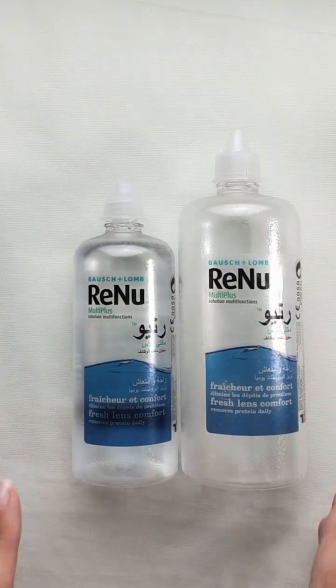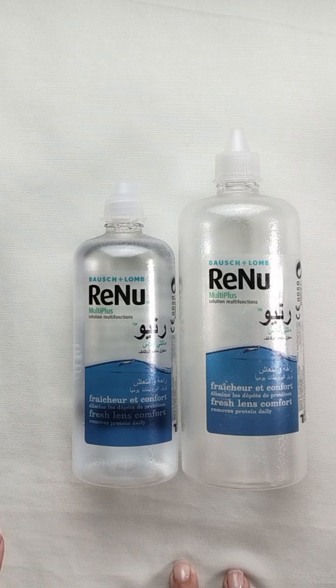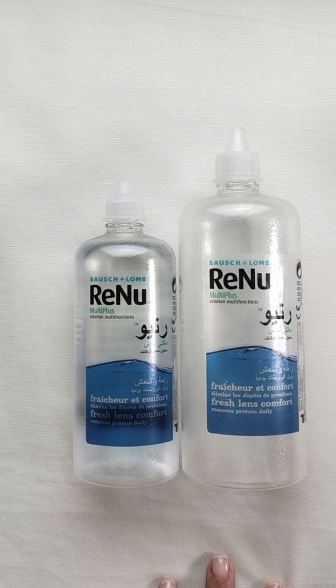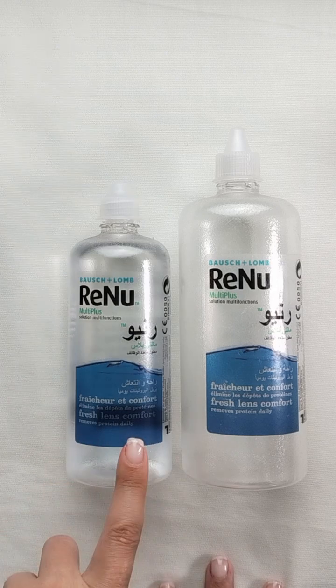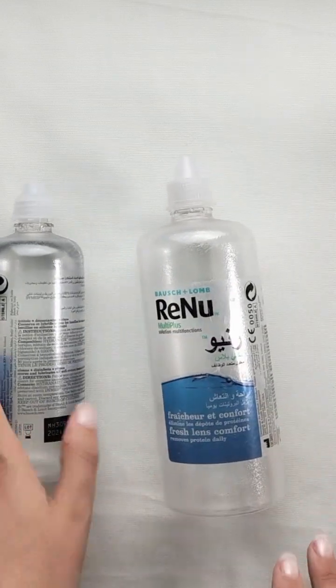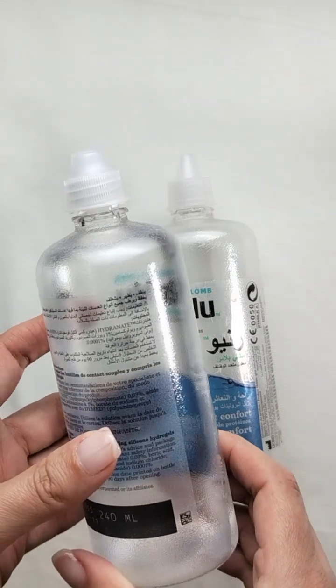I really love it because it makes my contact lenses very clean and very soft. It really dissolves any residue because I wear my contact lenses the whole day. I wear sunglasses all the time so I can't wear them over glasses, so I always wear contacts during the daytime. I need something to make my lenses fresh and clean, and remove protein and residue, so it won't harm my eyes. I've tried many brands but I always come back to this one.